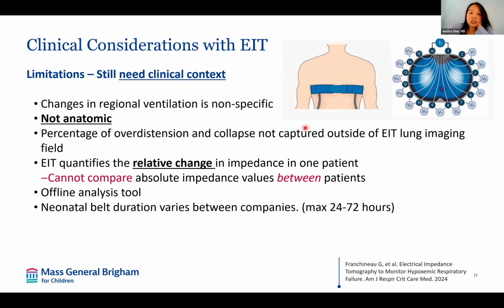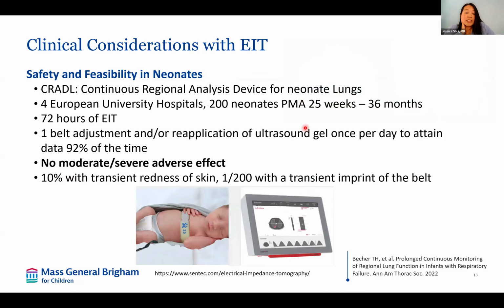A lot of the features that are currently being reported in the literature have to use the offline analysis tool that you're not able to use right at the bedside just yet. And then in terms of the neonatal belt, the duration of how long you can wear the belt varies between companies. Some could be as long as 24 hours and some as long as 72 hours. And it's very safe and feasible to use in neonates.